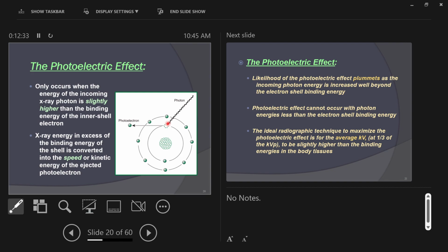Unlike charged particles, which can be attracted or repelled from each other, X-ray photons don't have any electric charge. They are not pushed or pulled toward anything. They just travel in a direction, okay? They travel in a straight line at the speed of light, and they carry energy. That's all that they do. They don't do anything until they absorb or interact with another piece of matter, like an electron. This is just a chance interaction.